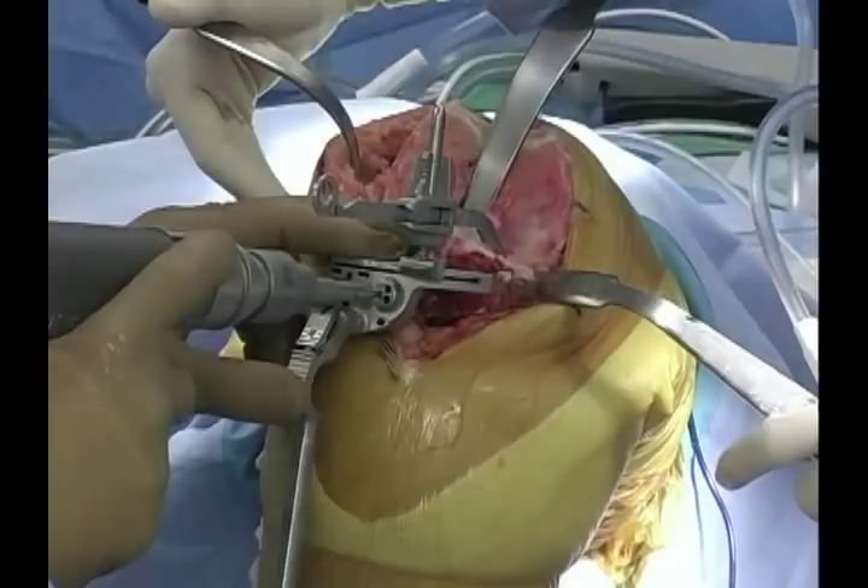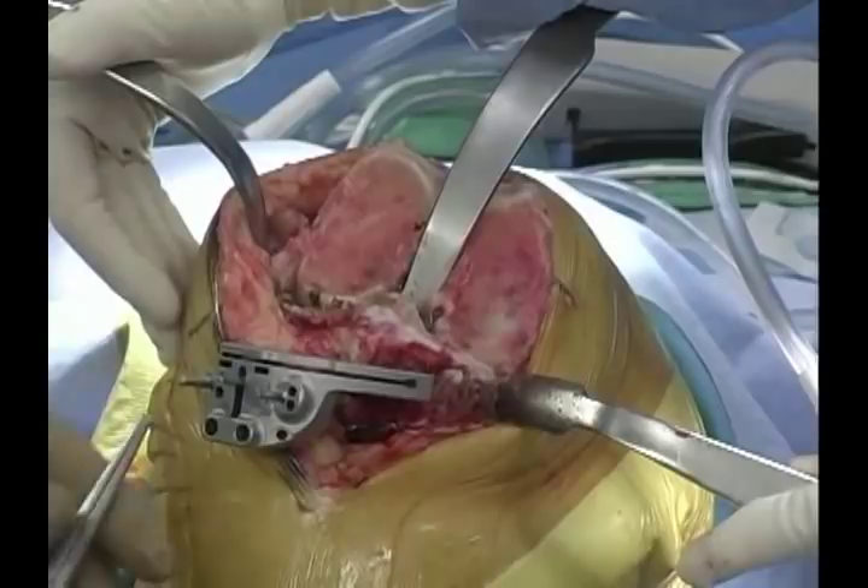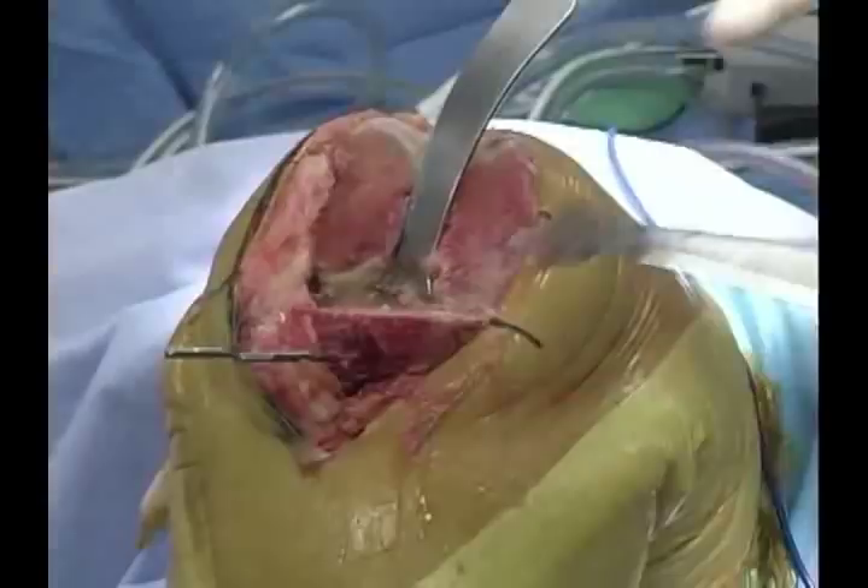We need a 10 millimeter insert, so our resection is about two millimeters larger than we might use with a fixed bearing knee. I chose to cut off the top of the block with the depth gauge, so I'm going to use the top surface for my resection.